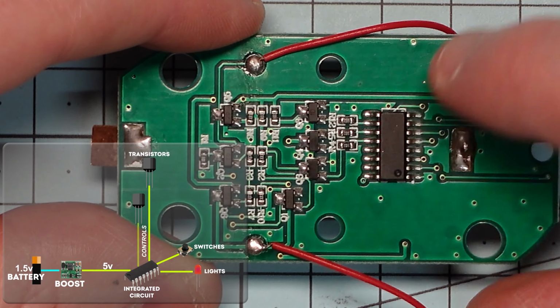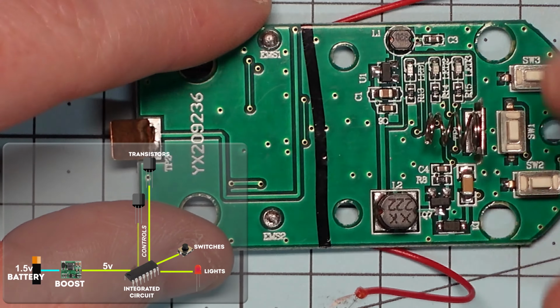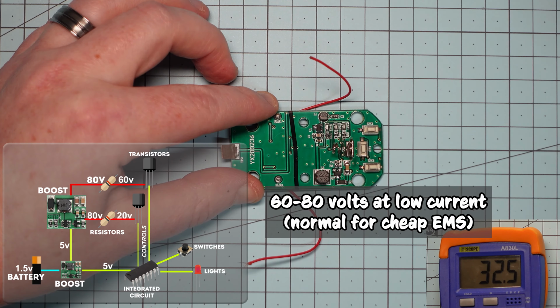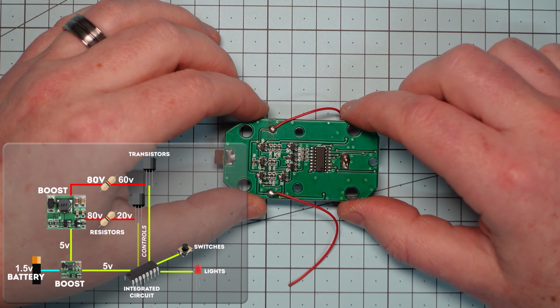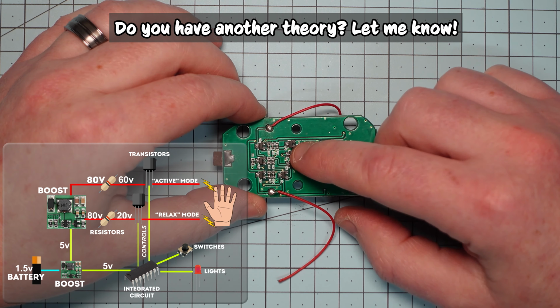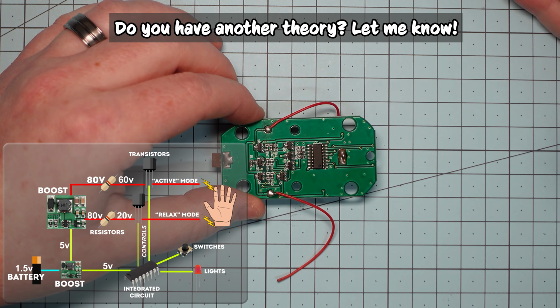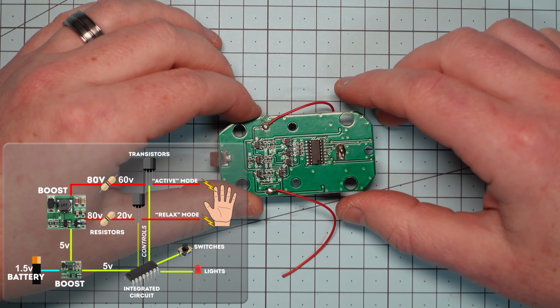So what it's doing is, it's using these transistors, I believe, to switch the much higher voltage that this is boosting it up to, around 80 volts maximum, so maybe 20, 30, 40, 60, 70, 80 volts, waiting here on a rail, and this is switching using the transistors to switch that on and off, different power levels, different patterns for different effects depending on what mode you're on, up to 80 volts.